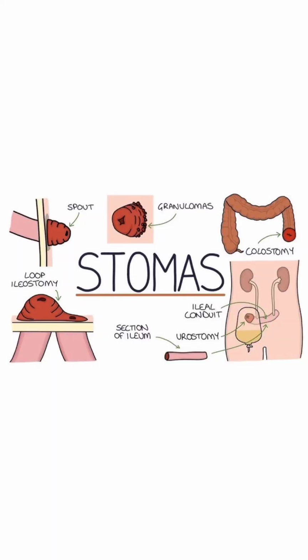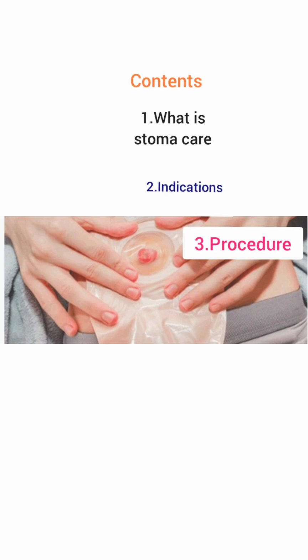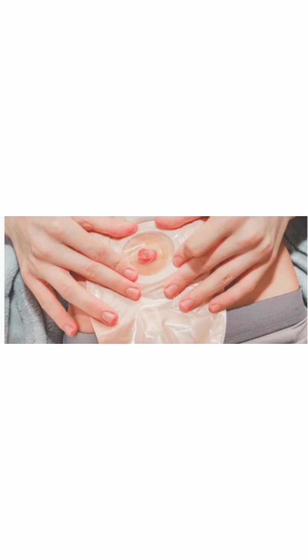Today let us learn about stoma. Today in this lecture, I will be showing the procedure of stoma care. I will also explain what is stoma care, what are the indications of stoma care. Mainly the procedure I will be demonstrating, and the complications of stoma.